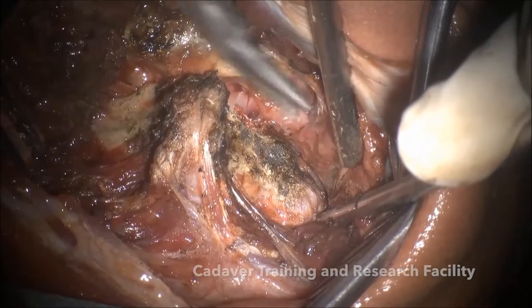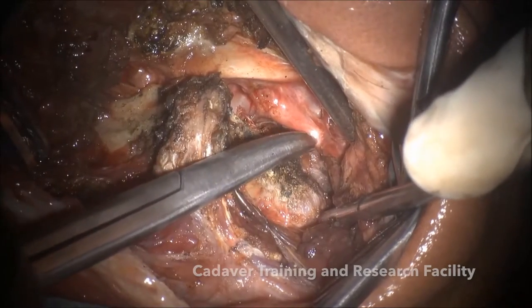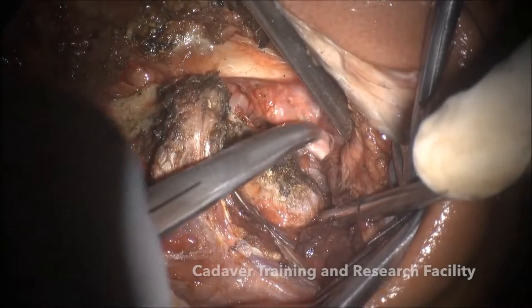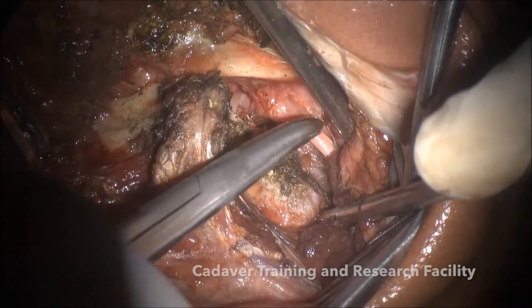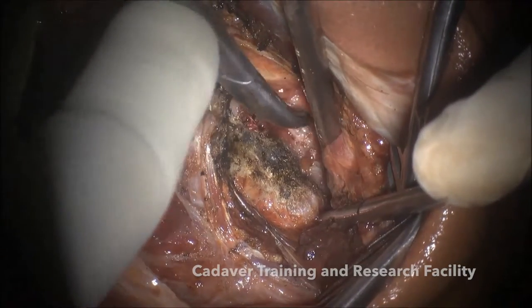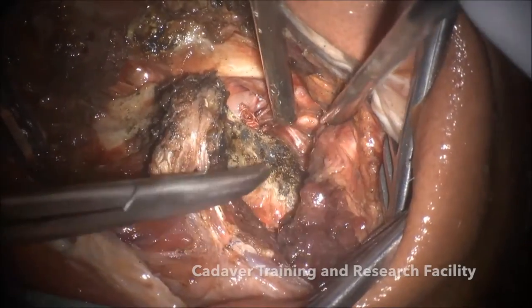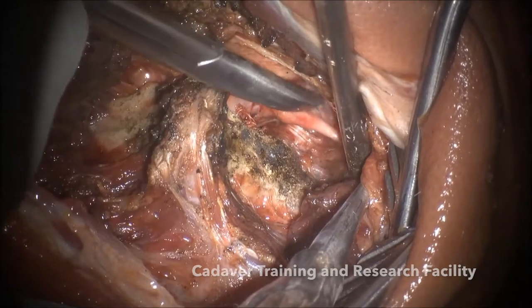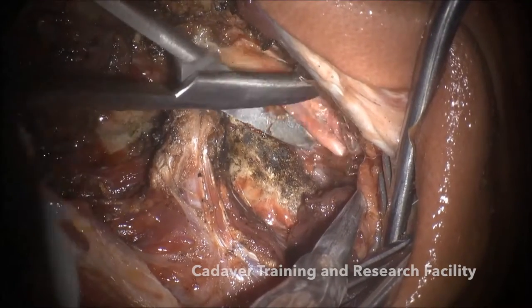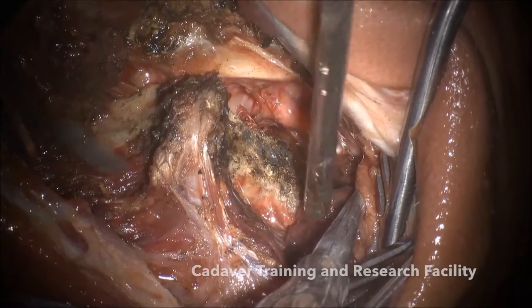Now you are seeing the C2 root. The C2 root — you can preserve it if it is very thin and not hypertrophic. You can just take a nerve root retractor like in this case and retract it upwards; then you do not have to cut it. Now the third point of bleeding is between C2 and the lateral mass of C1. When you start dissecting superior to the C2 root, that is where it starts bleeding. There is no fourth point of bleeding — there are only three.